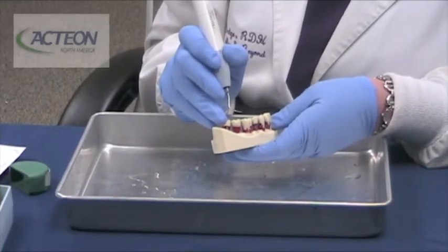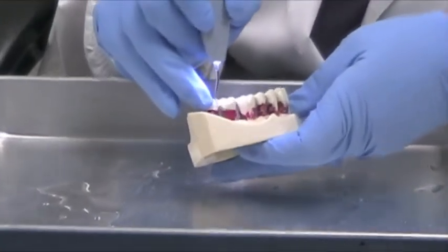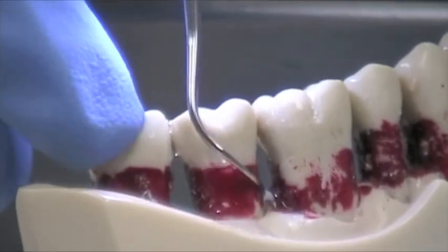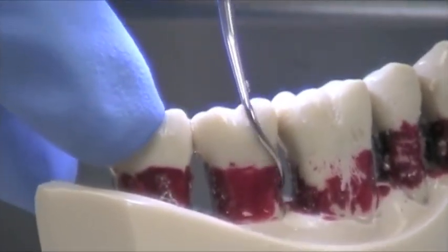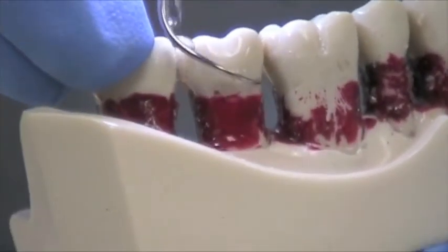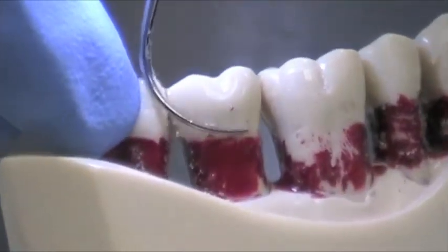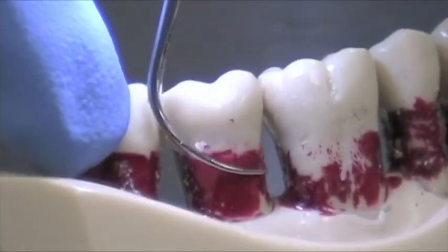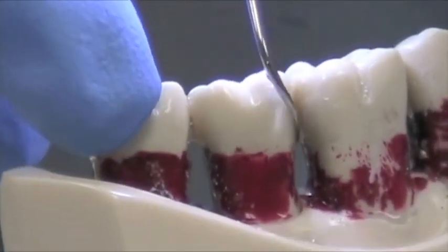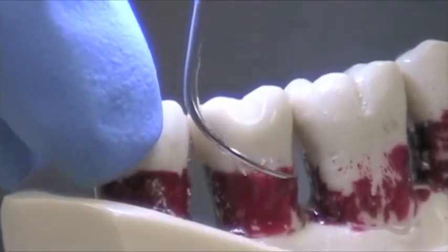Now we're going to demonstrate the TK-2-1L. This is the sister tip for the TK-2-1R, used for the buccal surface and the mesial. You can see how I can just roll the tip and go to the mesial surface. Again, it's not for calculus removal — very, very good for furcations. The shape is great for your periodontal maintenance patients who have either no calculus or very, very light calculus.